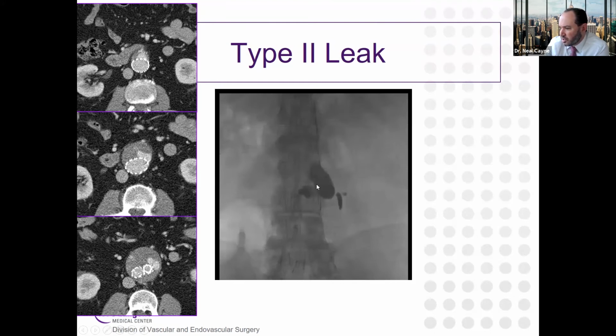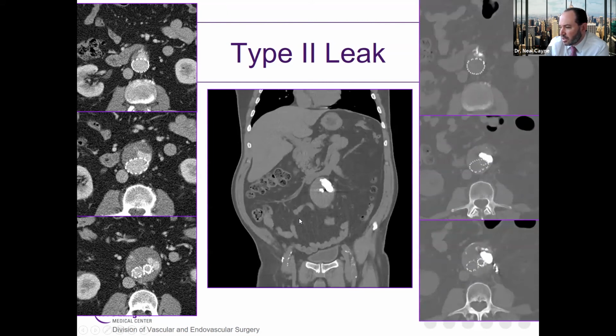After the glue embolization, you see the nidus is completely filled. And if you look at the non-contrast postoperative CT scan, you see that where the nidus was is completely filled with glue, as is the very origin of the inferior mesenteric artery in the top right, and the glue hugging the graft as the nidus did.